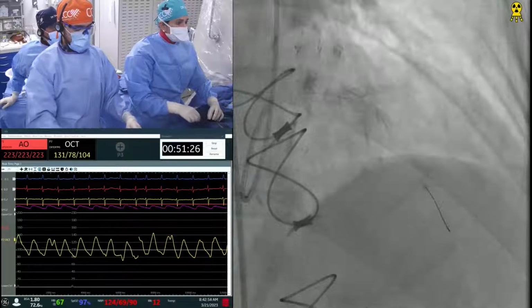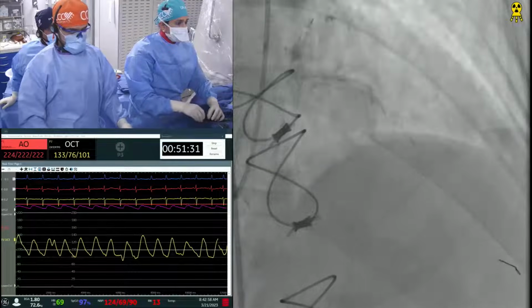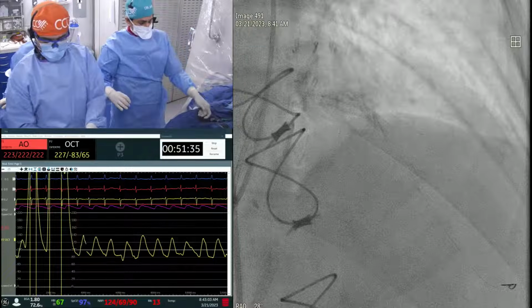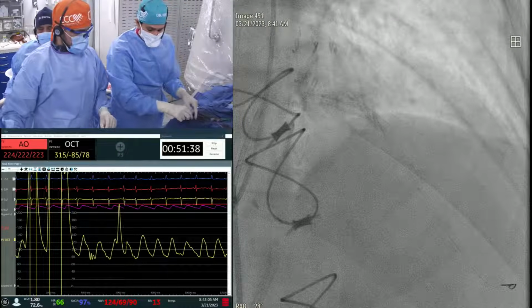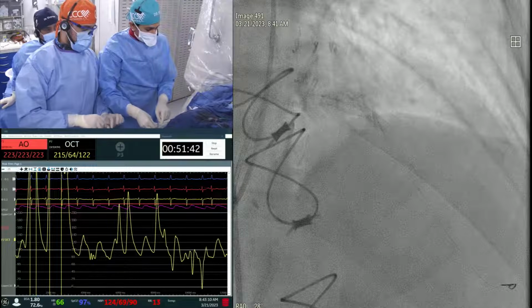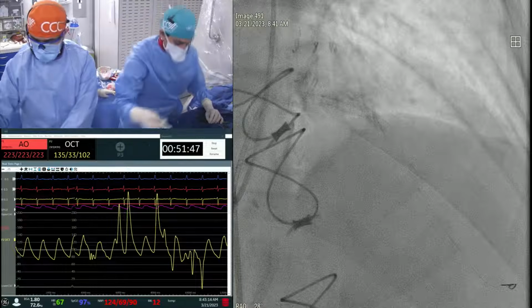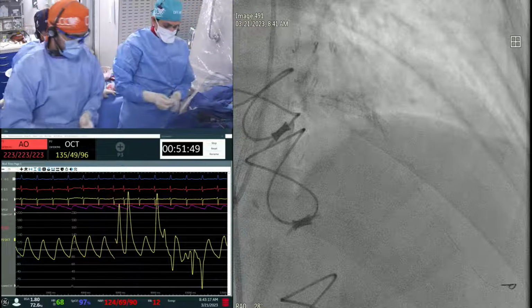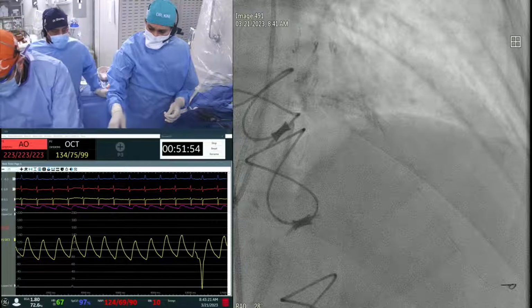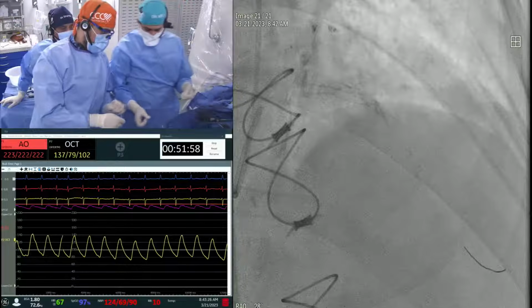What has been your experience just based on these cases? No, we are not using it yet. I would say our first case will be in mid-April, because our IRB just approved it. They had to start the site initiation, then get ready. But based on the literature, small vessel diabetics do better with the drug-eluting balloon compared to DES. Maybe in non-diabetics probably not a difference, and large vessels should still be DES as the default strategy.